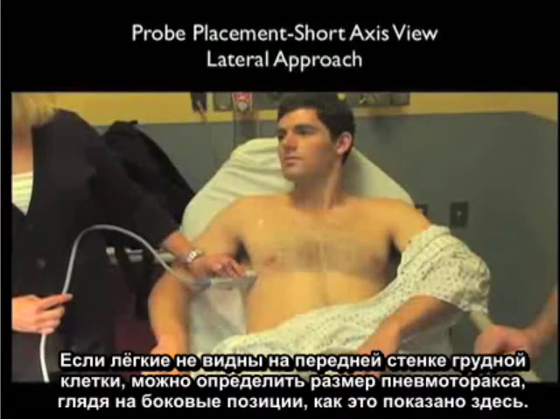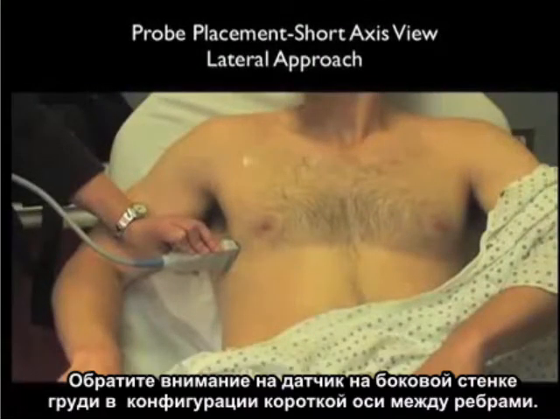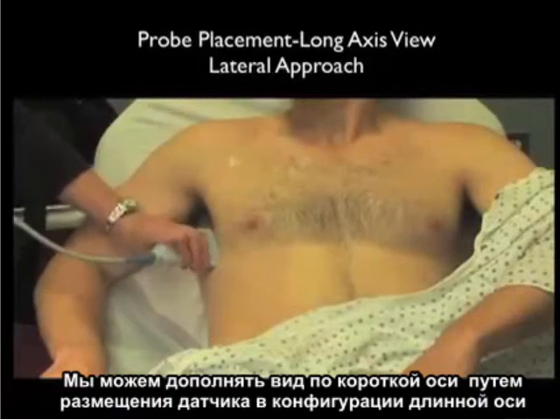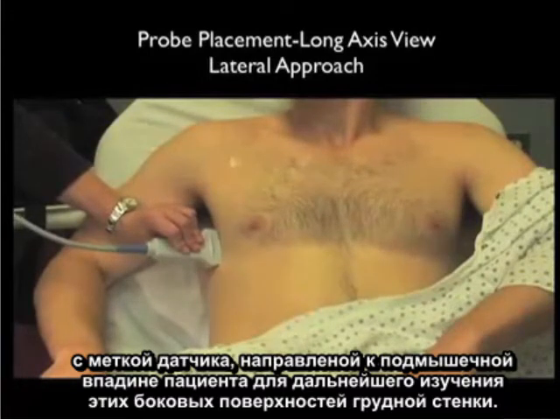If no lung is seen on the anterior chest wall, one can size out a pneumothorax by looking in the lateral positions as shown here. Notice the probe on the lateral chest wall in the short axis configuration between the ribs. If lung is seen here laterally, but not anteriorly, this would tell you it was an incomplete pneumothorax. We can complement the short axis view by locating the probe in the long axis configuration with the marker dot towards the patient's axilla to further examine these lateral areas of the chest wall.